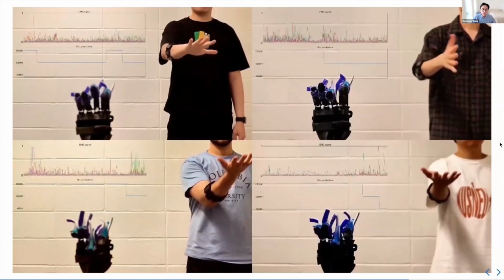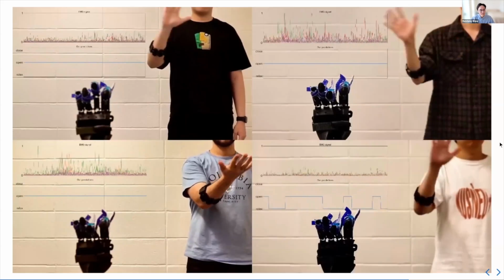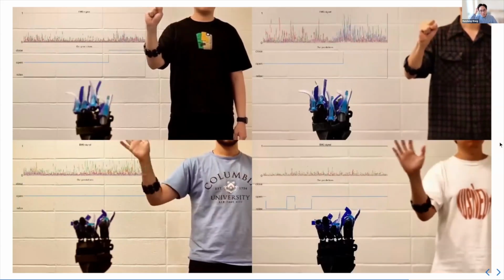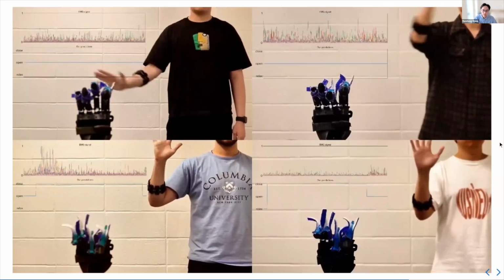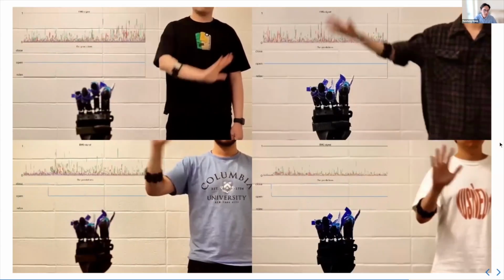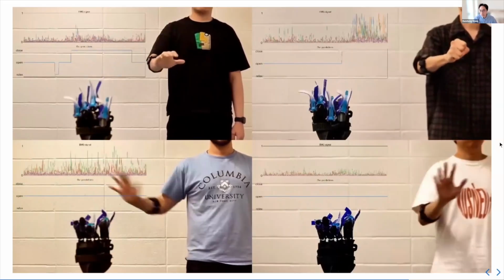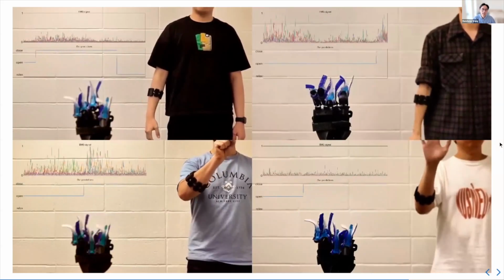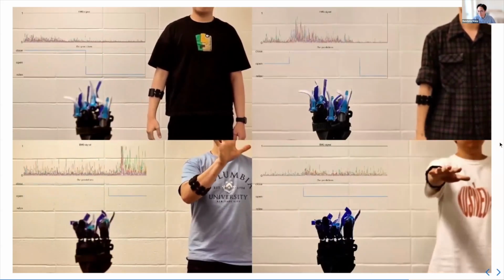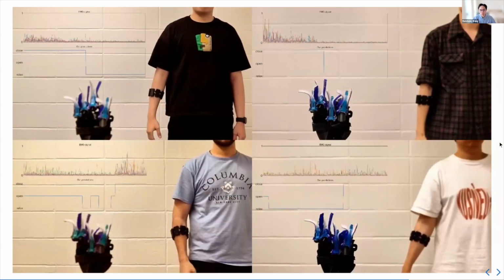And also, in a second, you will see people trying to wave their arms very randomly, so that we're trying to show that it rejects noise. So it rejects different gestures. And you will see that it's not perfect. It makes mistakes. But generally, it works reasonably well on unseen, healthy subjects. And you can find the full video online, of course, if you're interested.